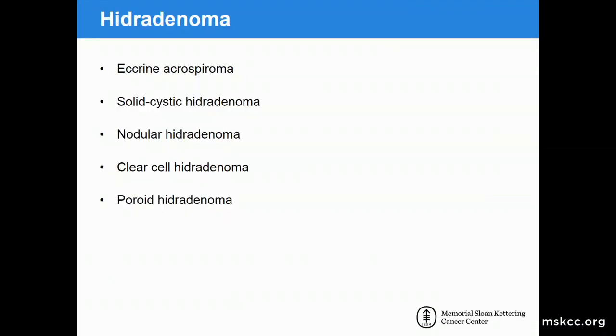So those are things that we would think about from the breast. Now, what about skin adnexal tumors? It's something that, this patient, it was a superficial lesion, periareolar. We also need to think also of adnexal tumors. So Hidradenoma is a lesion that came to mind.